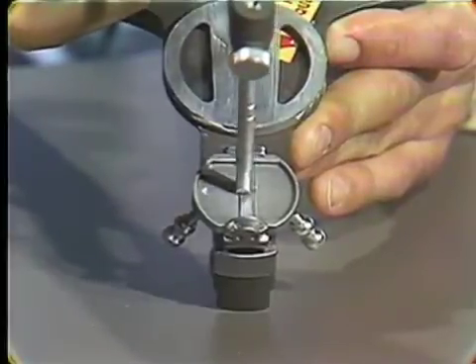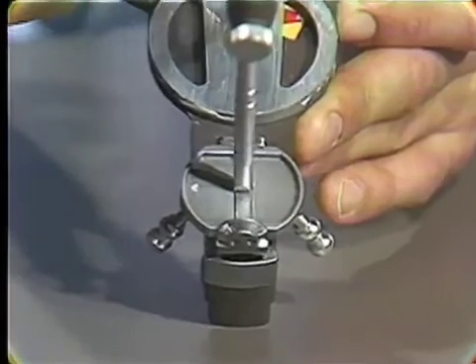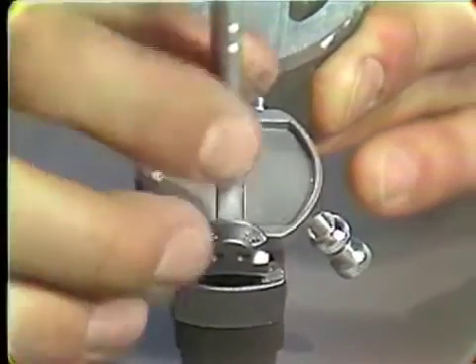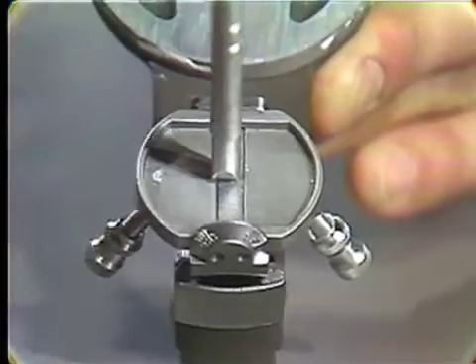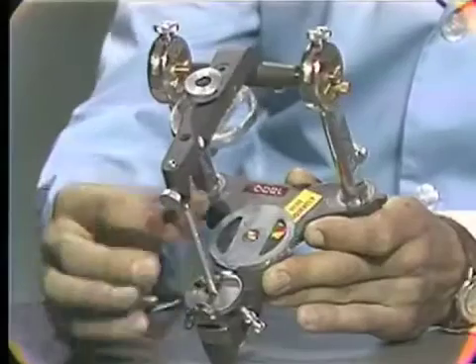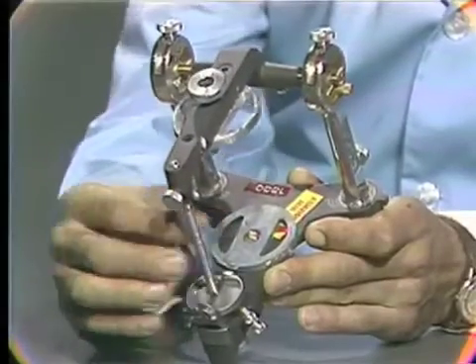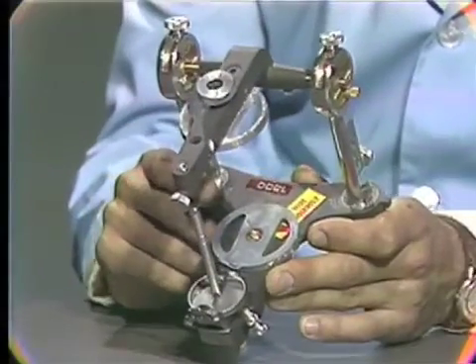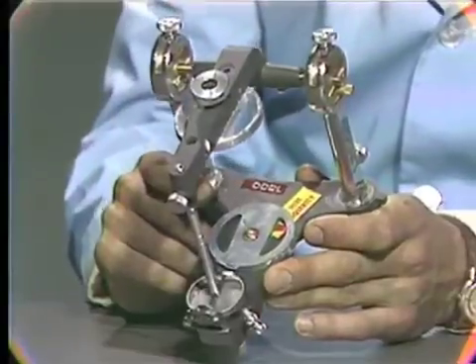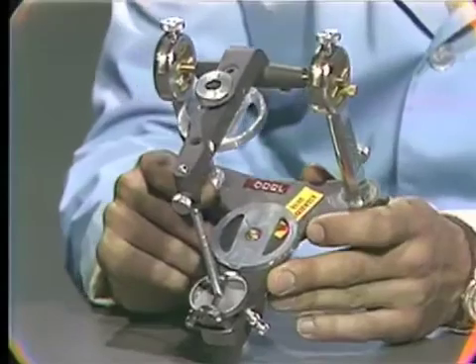Now if one was using this articulator to mount in centric relation, you could close the articulator in this position. Or if by accident you happened to be over in this position, you could also close it. You would end up having two positions — one time you'd close the articulator and find interferences in one area, and the next time you'd close it, you'd find them in another area.